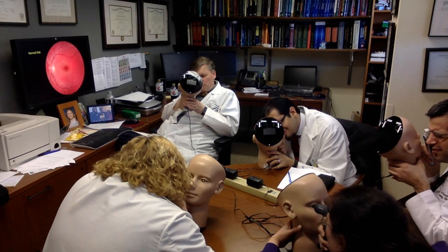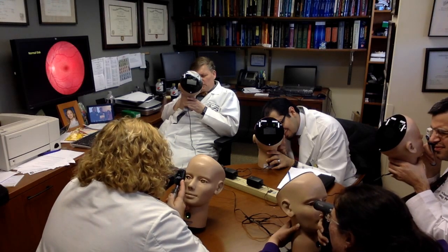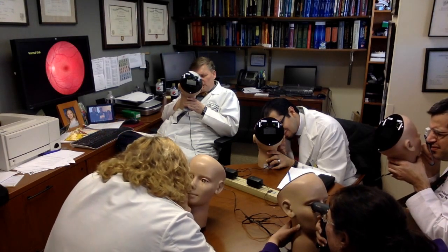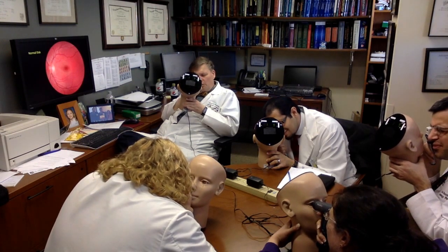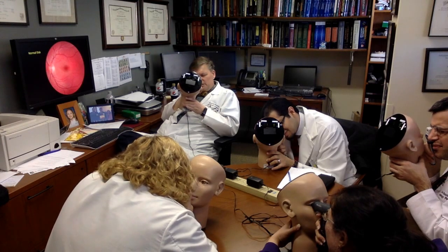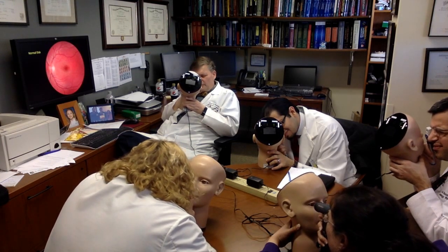Notice that it's sharp. Look at the cup. We can see it's white. It's roughly a third of the disc. Look at the blood vessels, the veins and the arteries. Kind of follow them down and over, up and over. And when you're done, look at the macula in the middle. That's what you want to do.